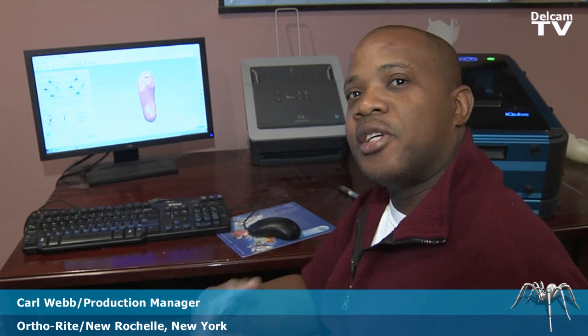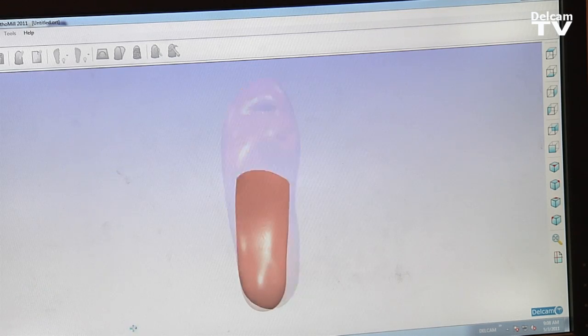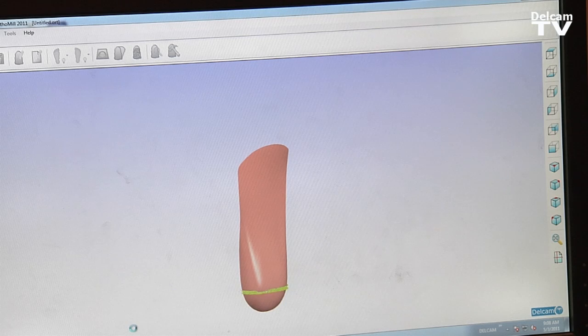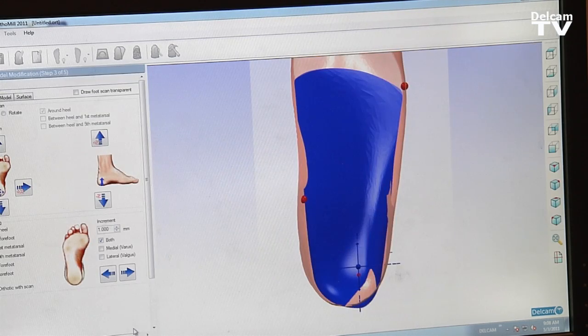We could design cases easily and better. The steps are very clear and simple. We create the STL file through the OrthoMill program and then send it down to the milling machine.